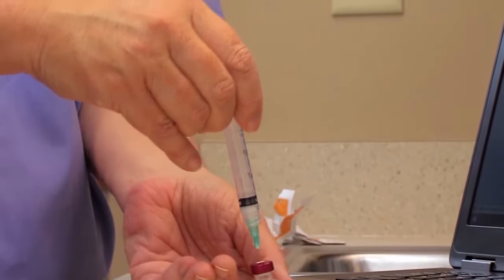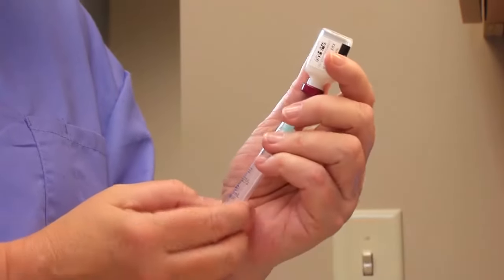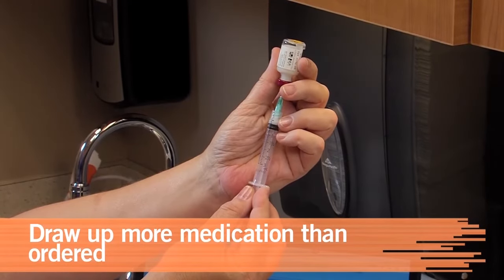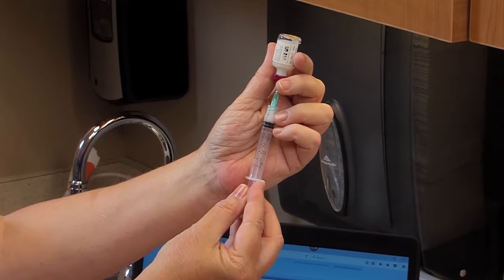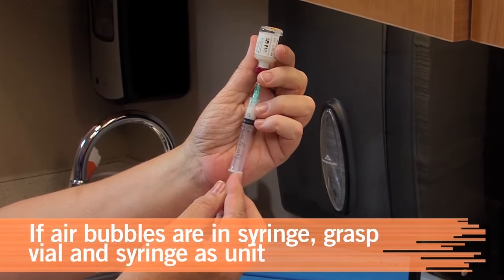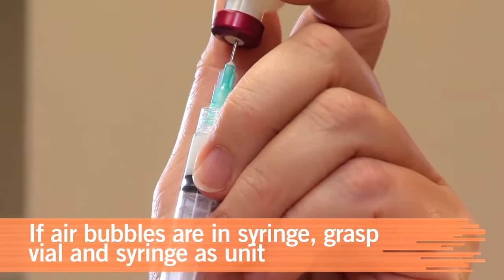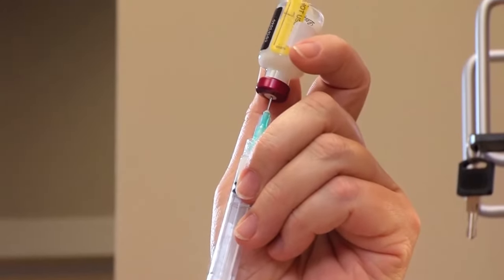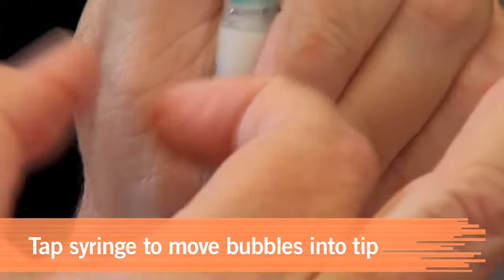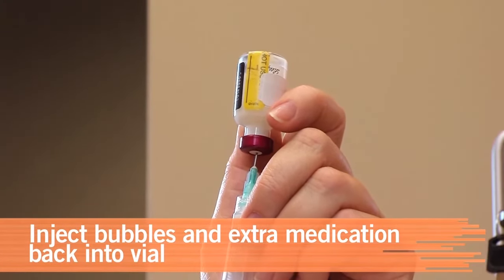Without removing the needle, carefully pick up the syringe and vial and invert them. Hold them at eye level and slowly pull back on the plunger to draw up more medication than ordered. While the needle is still in the vial, check for air bubbles in the syringe. If you see any air bubbles, move the hand with which you're holding the vial down to hold the syringe as well. With your free hand, tap the syringe until the air bubbles float into the tip of the syringe. Inject any air bubbles and extra medication back into the vial.